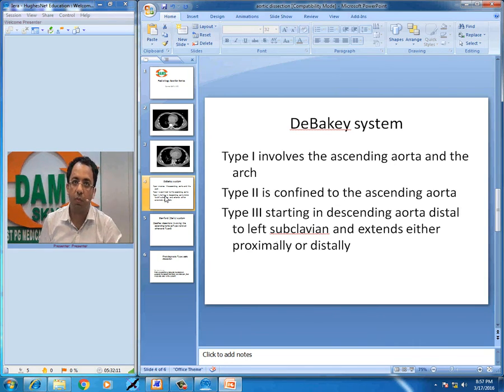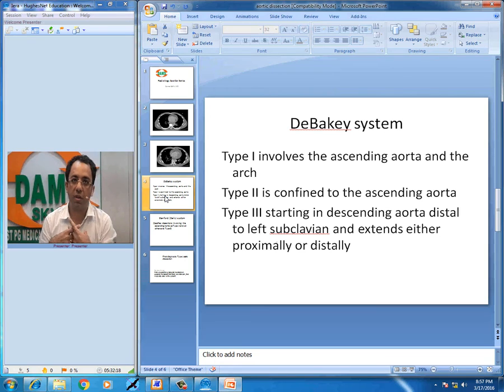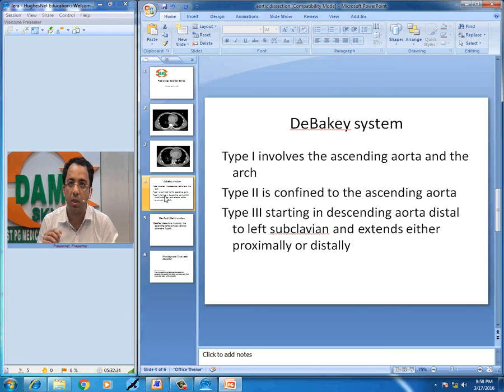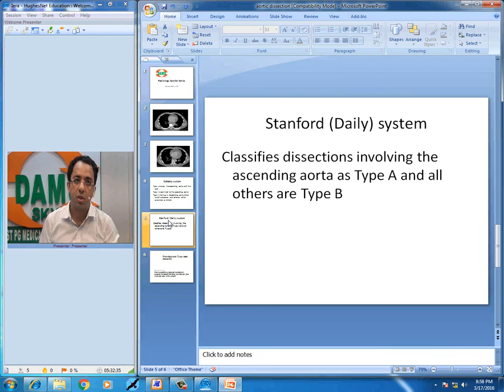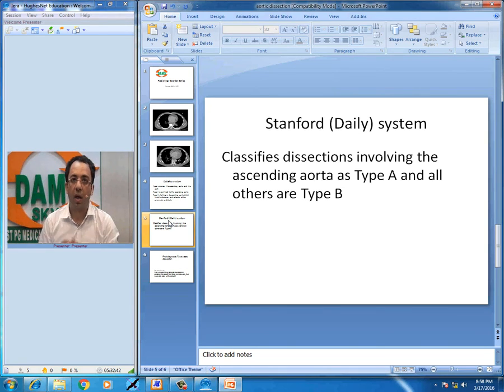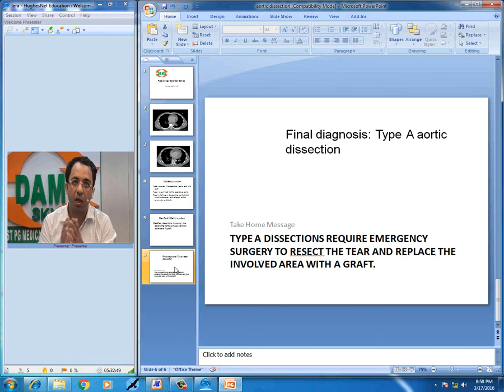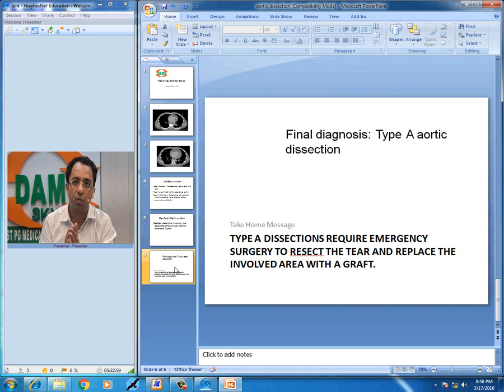Whenever you look at aortic dissection, there are classifications which help you label them on your report. The DeBakey system classifies it into three types: Type 1 involves the ascending aorta and the arch; Type 2 is confined to the ascending aorta; and Type 3 starts in the descending aorta, distal to the origin of the left subclavian artery. The Stanford classification categorizes dissections involving the ascending aorta as Type A, and all others as Type B. This would be a Stanford Type A aortic dissection. Type A dissections require emergency surgery to resect the tear and replace the involved area with a graft.